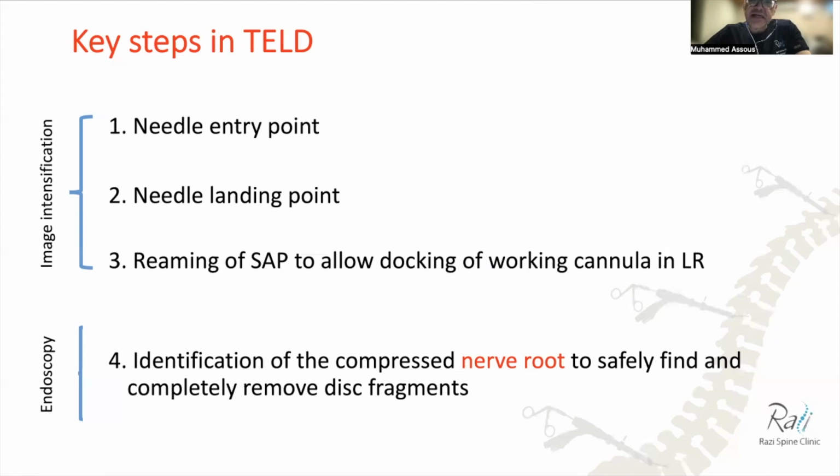If this is a foraminal or extraforaminal disc, you will do this later. Then you will find the exiting nerve root, and in the axilla of it will be a foraminal hernia. A bit lateral to that will be an extraforaminal hernia.